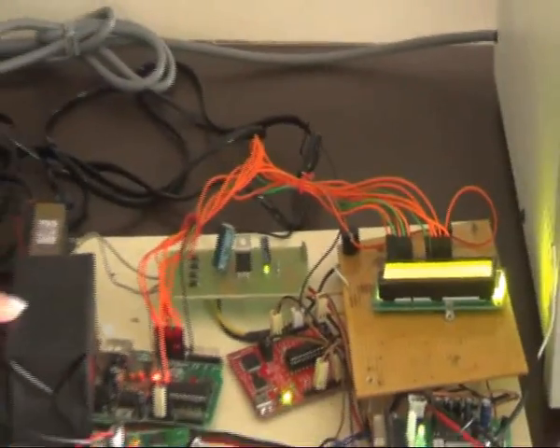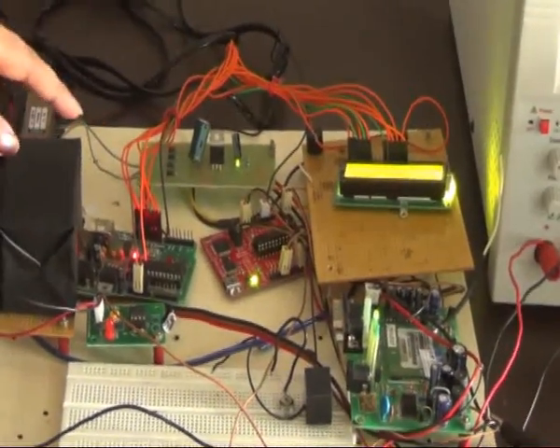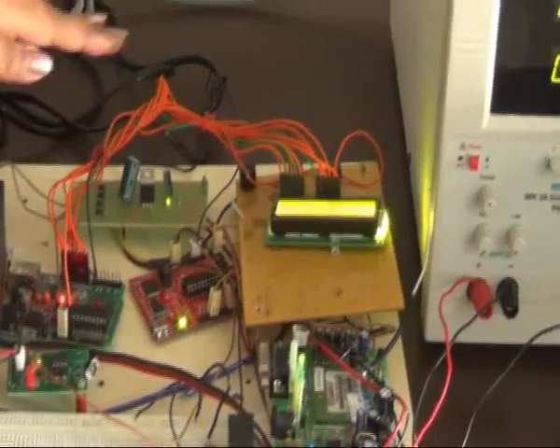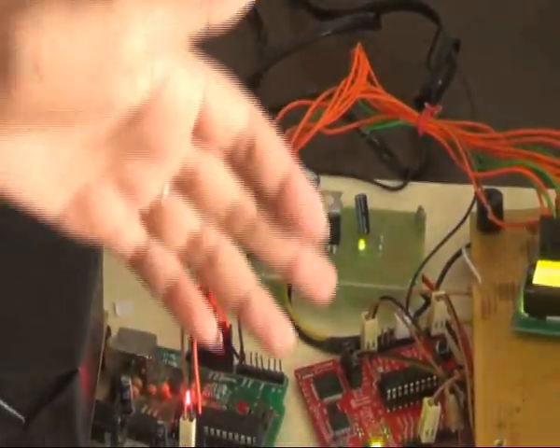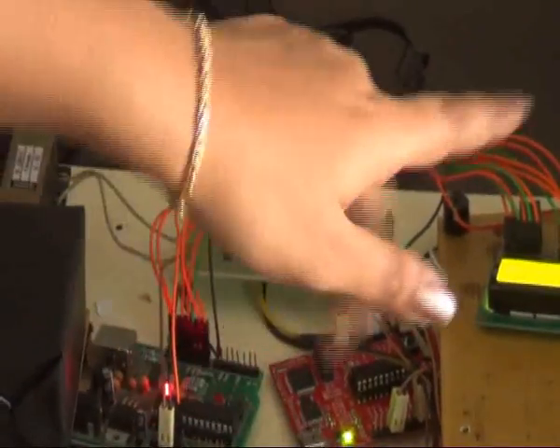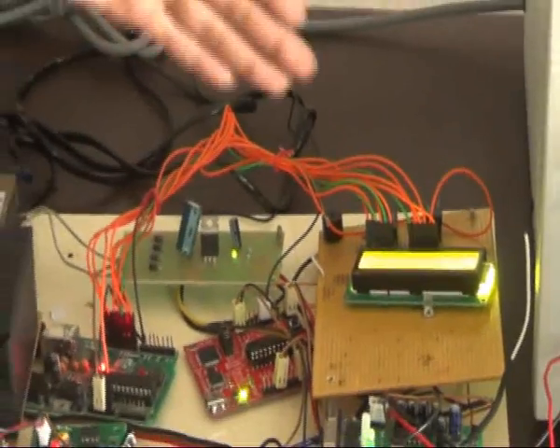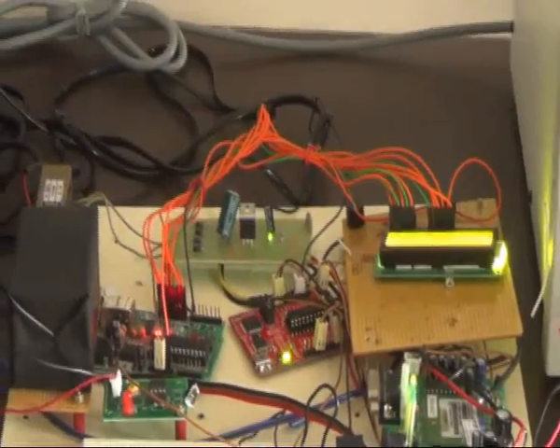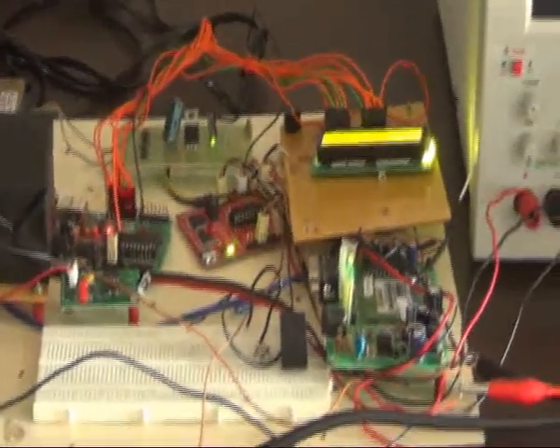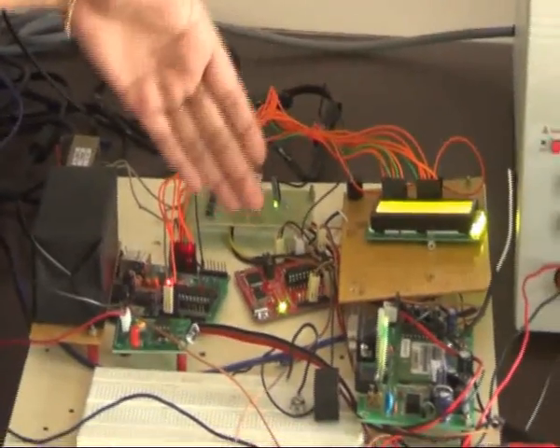In this hardware, initially the heartbeat is calculated using the heartbeat sensor, and it is given as an input to the control unit. The converter here converts the input voltage, that is the AC signal, into the required DC signal and gives it to both systems, that is 24 volt for the control unit and 5 volt for the display. The display describes the patient system which is monitored there, and its levels are indicated in the display system. The converter, after converting the signal, gives it to the control unit.